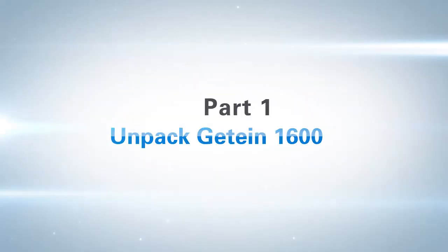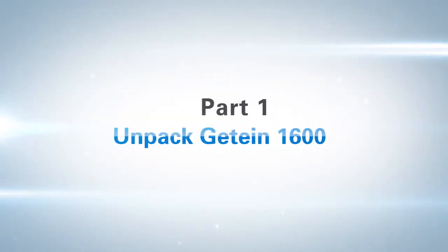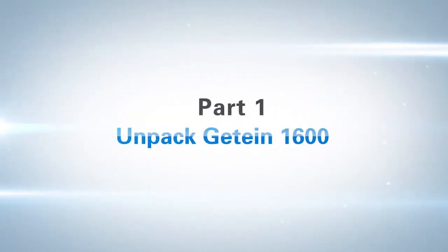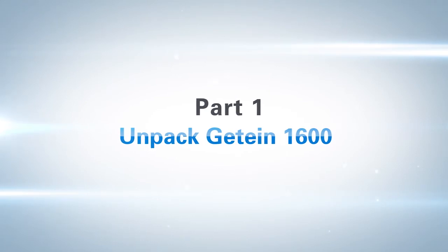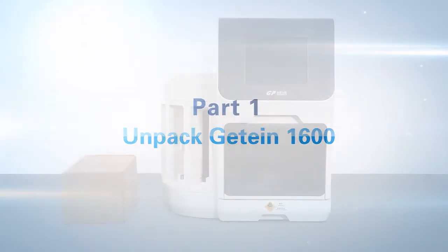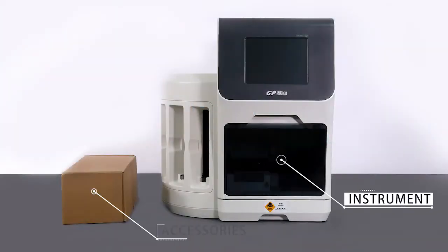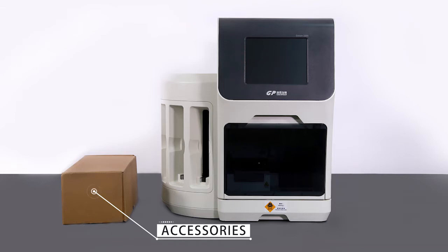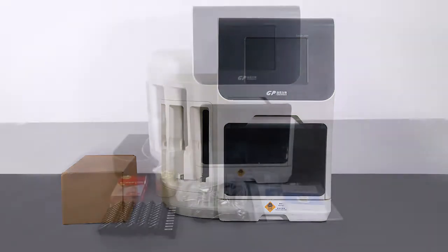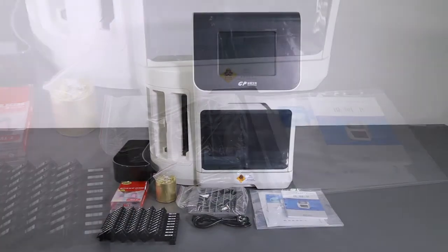Part 1: Unpack Getein 1600. Check the instrument and accessories. Refer to the packing list.